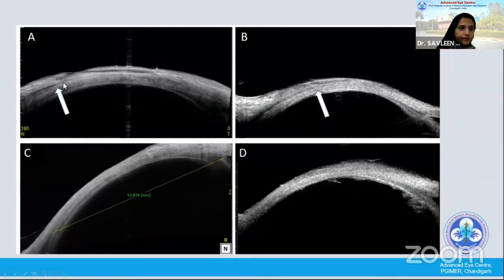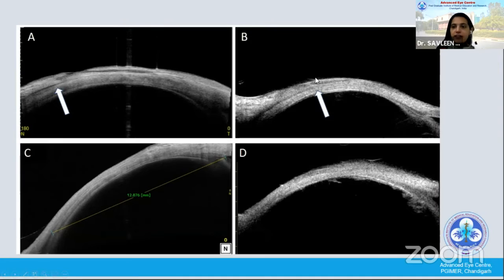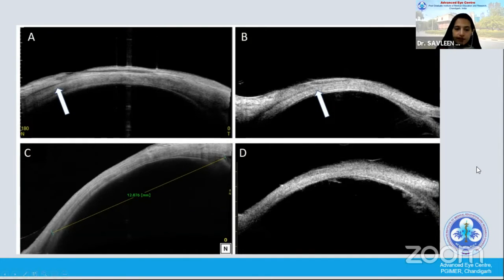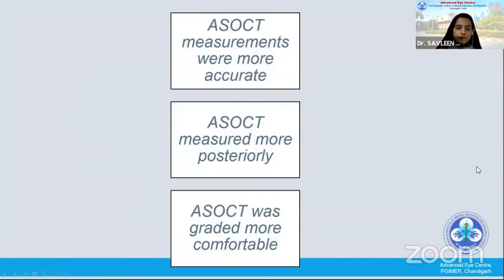Further, on ASOCT, sometimes very thin fibrotic muscles can also be identified which might be difficult to identify on the UBM. Large distances of around 13 mm on the ASOCT are easily measured, whereas on the UBM sometimes you cannot localize these muscles.